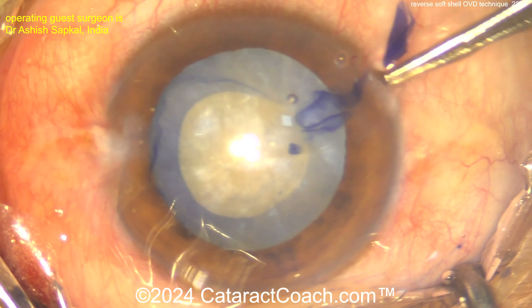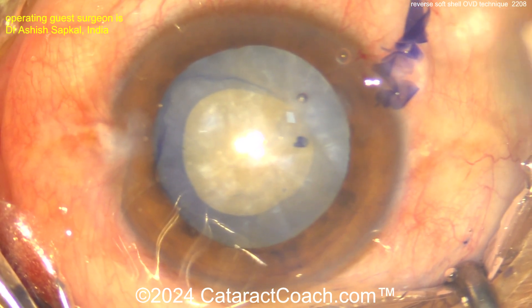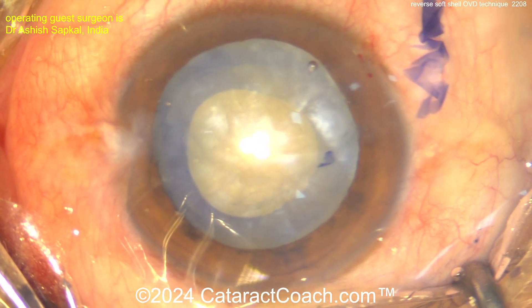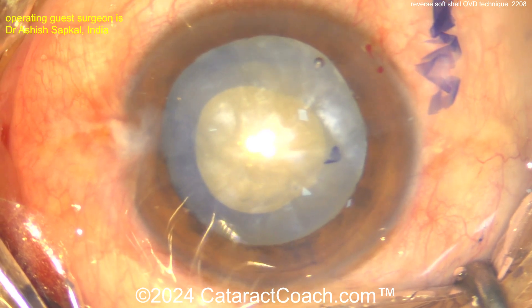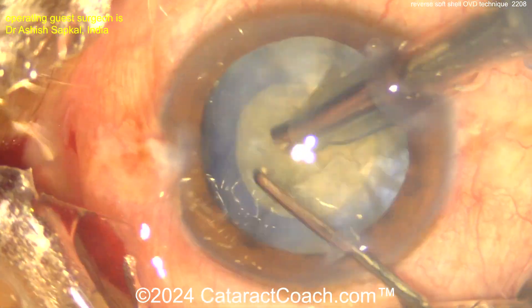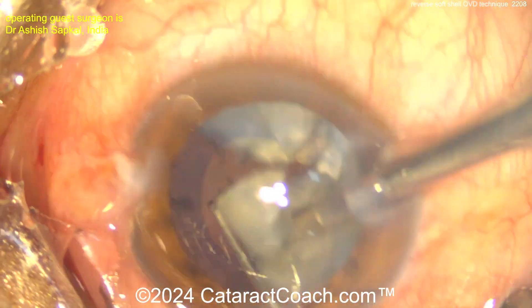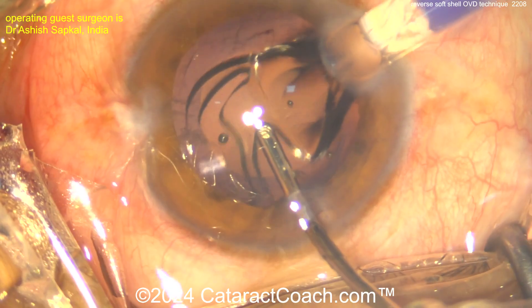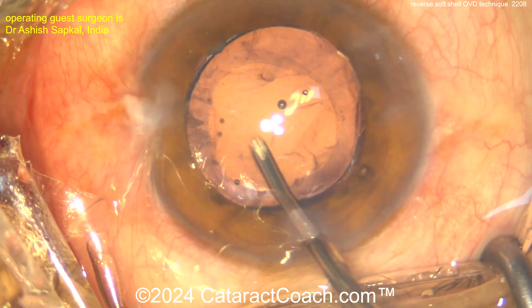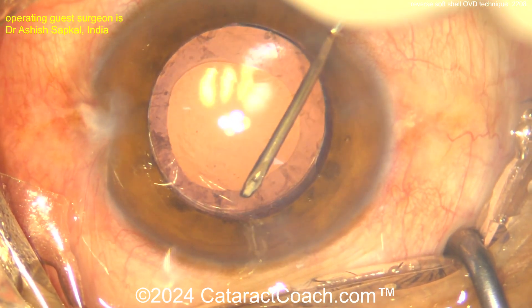The nucleus was rocked a little to help the intumescent lens liquefied cortex — which is behind the nucleus in front of the posterior capsule — come around too. It looks great: a beautiful four-and-a-half to five millimeter capsulorhexis that obviously didn't run out at all. Nucleus removal will be pretty standard. End of the case, lens in the bag — probably a six millimeter optic so maybe a four-and-a-half millimeter rhexis — and the patient has a nice outcome.